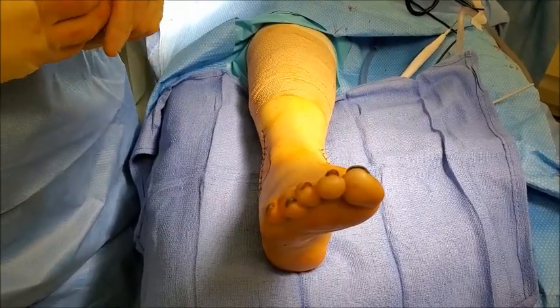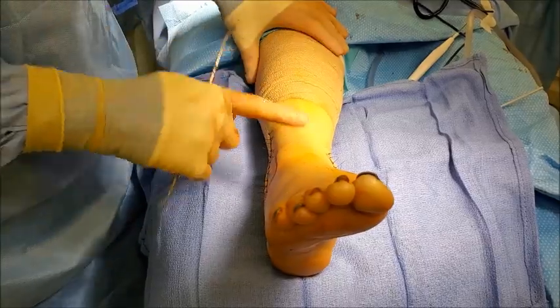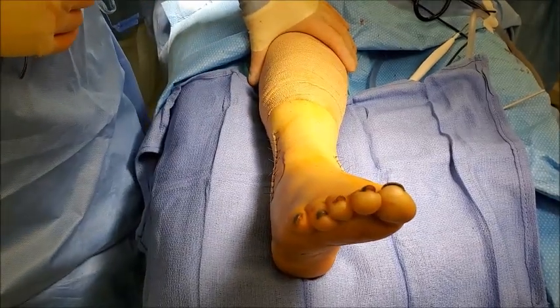Most people are in a boot for about four weeks. So at that eight-week mark after surgery, they'll return to their normal activities. And that is the repair of a trimalleolar ankle fracture.